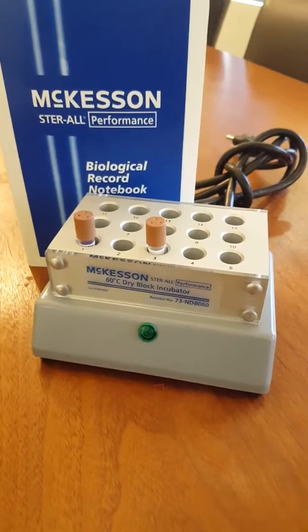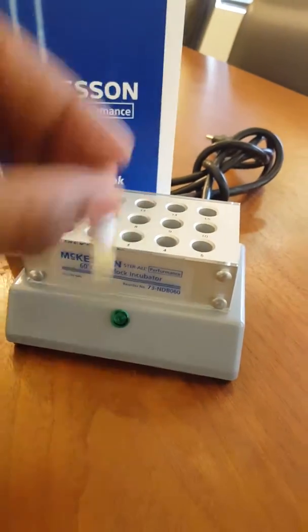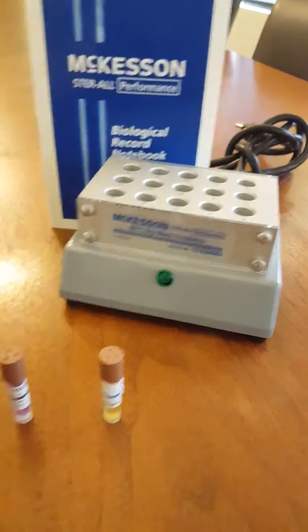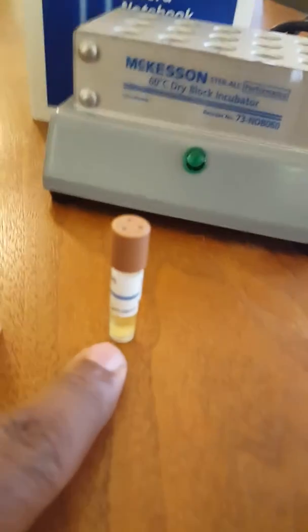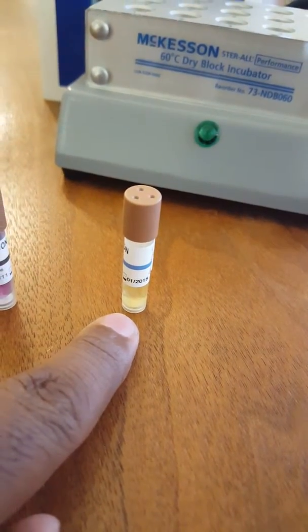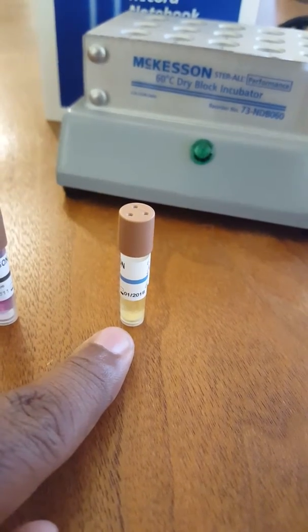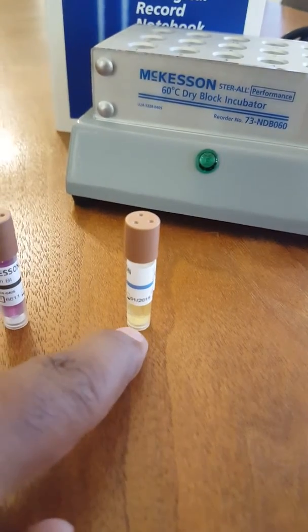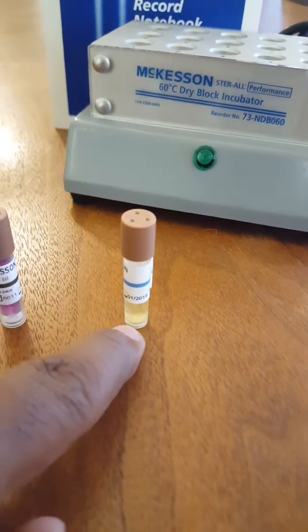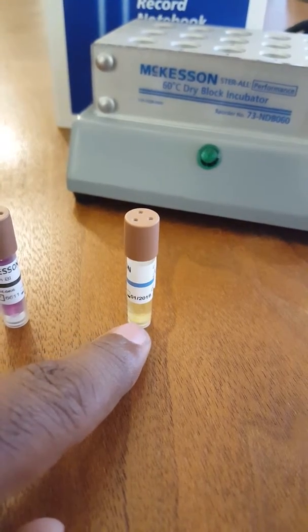After sitting for 24 hours, we're going to remove them from the incubator. And what we're checking here is to confirm that the control actually did grow the spores. The way that you're going to know this is it's going to change in color. It's going to be a yellowish, or some people say greenish color. That shows that the spores that were on the little pad, when mixed with the medium, did grow spores within that 24-hour span.